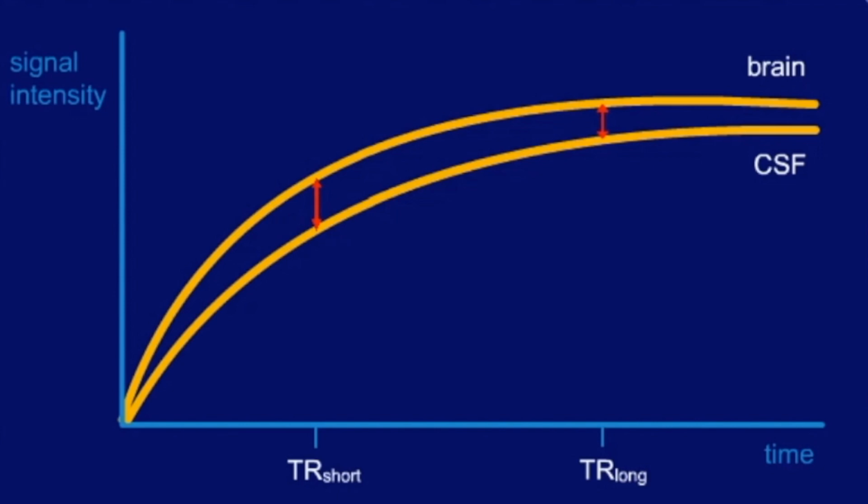And as we can see from the distance between the two curves, there is a time span where tissue contrast is most pronounced.